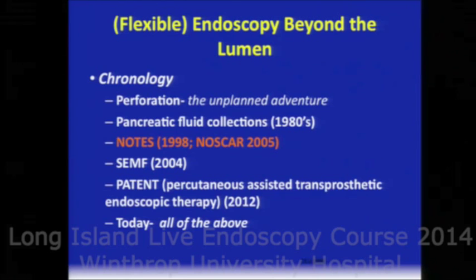Our concept of tunneling began in 2004. We excited ourselves when we realized we could safely turn the submucosa into a working space and exit into body cavities, especially the chest, safely and without remorse.